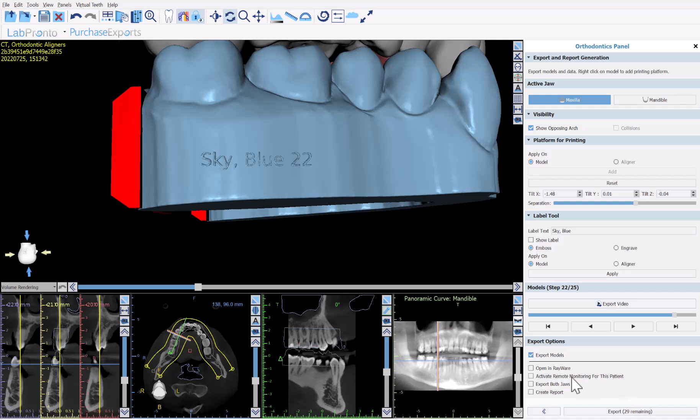We have the ability to activate remote monitoring for the patient. If checked at export, it takes the data from Blue Sky Plan and sends it to Blue Sky Monitoring, setting everything up for the remote monitoring system. A dialog box opens to enter patient information, create an automatic scan request, and schedule appointments. This enables you to compare models for a particular aligner step to actual photos or videos received from the patient.